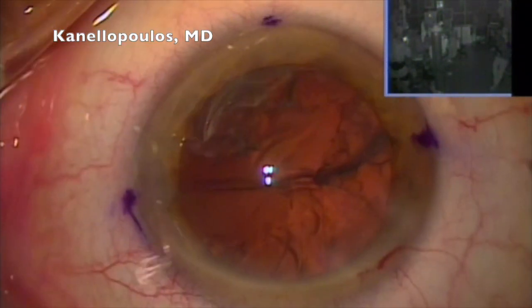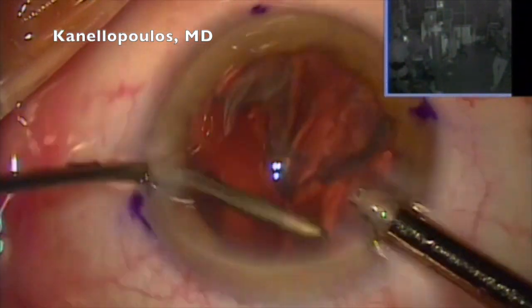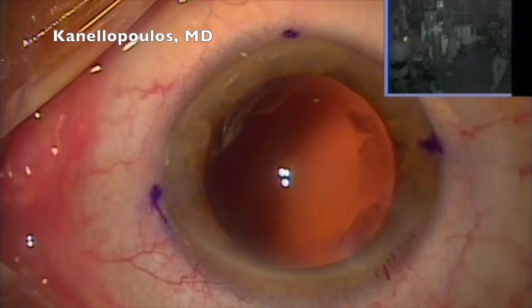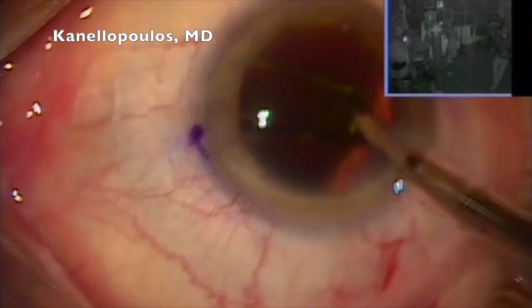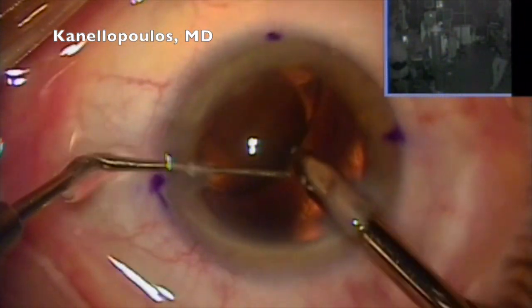Patients squeeze a lot, and you can see that at the end of the procedure, I need a deep chamber and a calm patient to be able to center my lens. Moving the cortex here, polishing the posterior capsule, filling in with methylcellulose. Here's our lens, slightly hyperopic patient, significant astigmatism though, over 2 diopters on the lens. Lens folded, in place. Remove the residual viscoelastic under the lens.